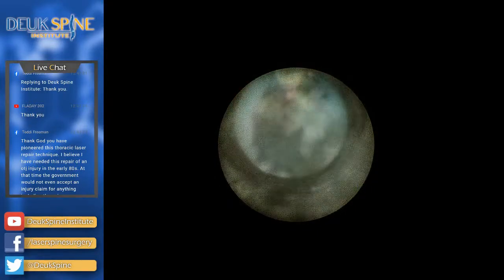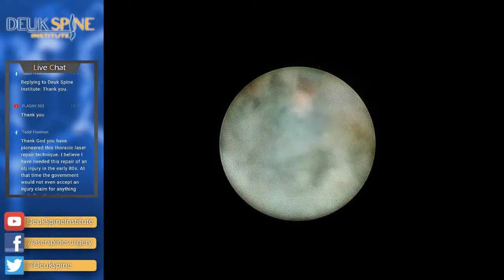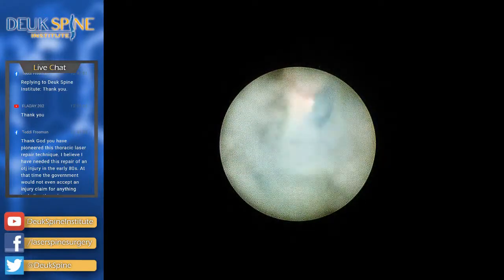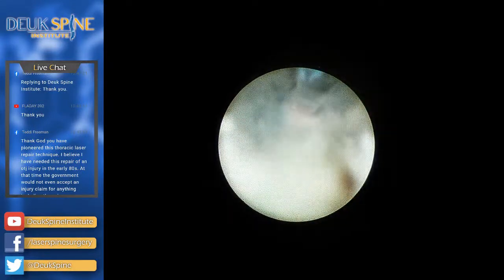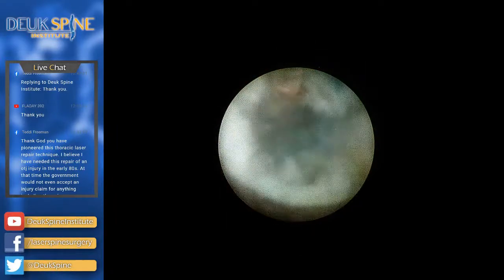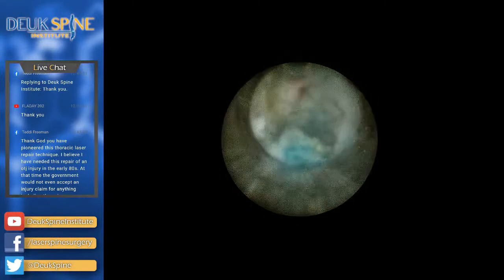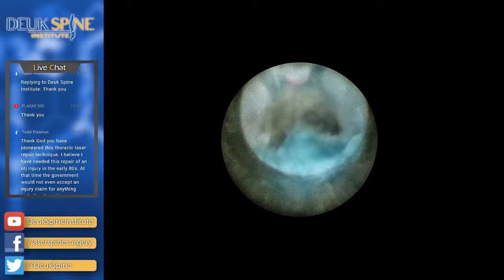If I remove that interposed nucleus pulposus, that allows the annular tear to heal, but I still need to do a debridement. If you don't debride the annular tear, it won't heal. It's just got too much grunge in it to heal on its own. So I have to help it heal by removing not just the interposed nuclear material, but also debriding the annular tear itself. And that whole process of removing the edge of the annulus so it will heal, removing the nuclear material that's wedged in there, that is called the annular debridement. And that's what makes this surgery so unique from all other surgeries, is that this is the only surgery in the world that does that.